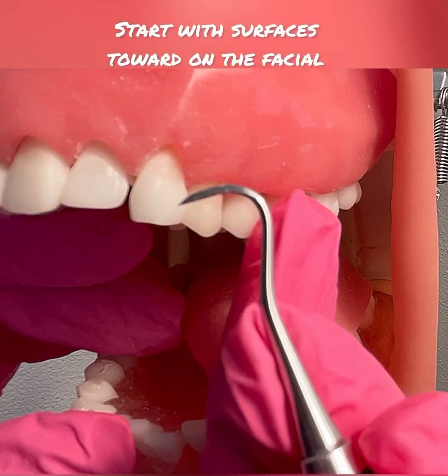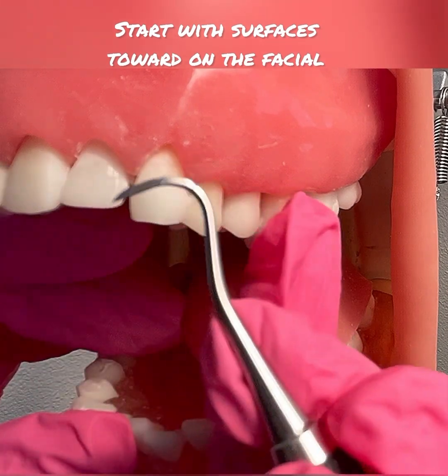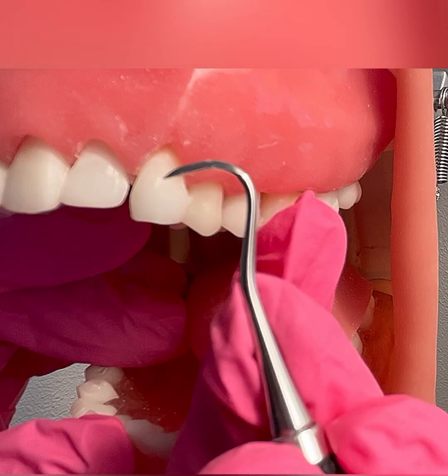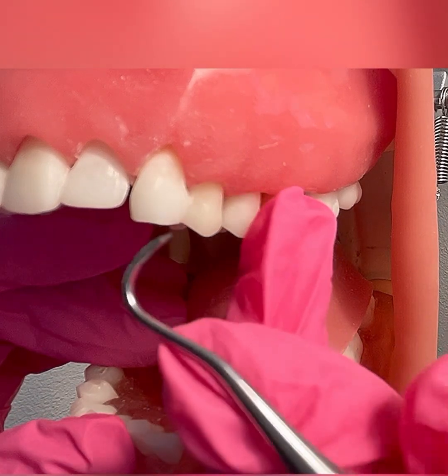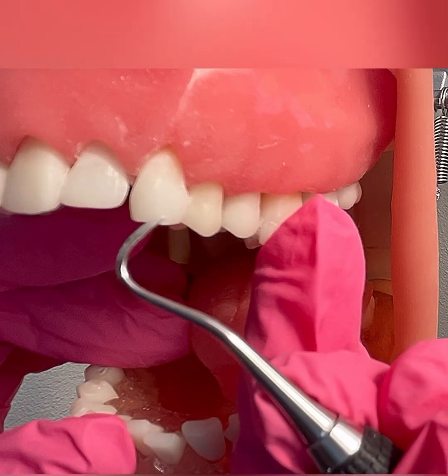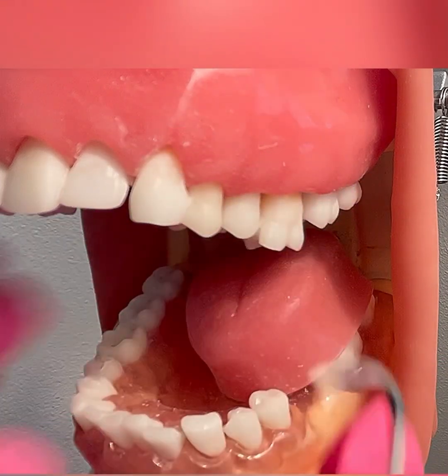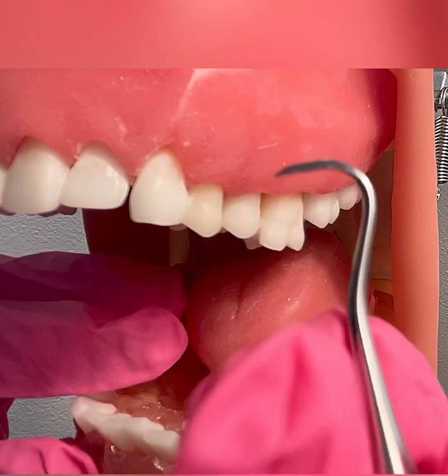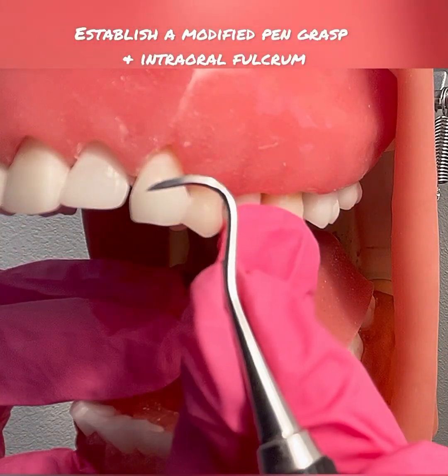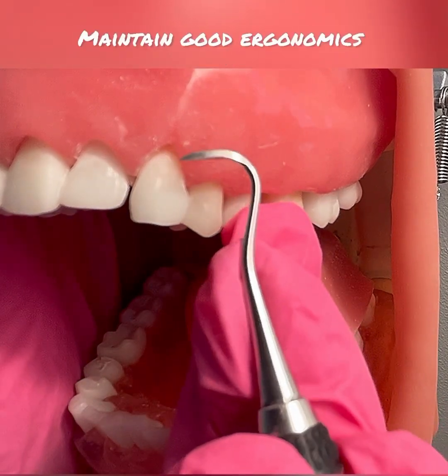For right-handed clinicians, you will start on tooth number 11, working your way to tooth number 6 for surfaces towards, sitting at 8 to 9 o'clock. For left-handed clinicians, you will start with tooth number 6, working your way to tooth number 11 for surfaces towards, sitting at 3 to 4 o'clock. Because I am right-handed, I am going to start with tooth number 11. I have a modified pen grasp, I'm sitting at 8 to 9 o'clock. I'm going to establish an intraoral fulcrum, and I have good ergonomics.